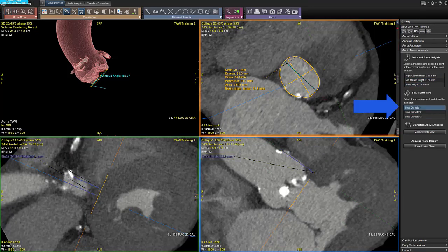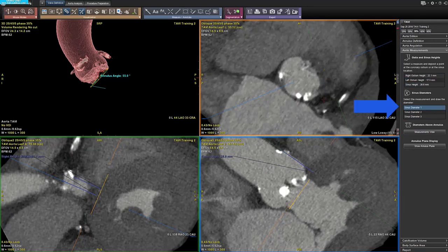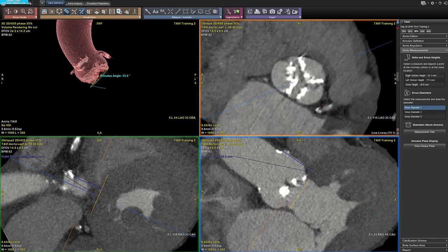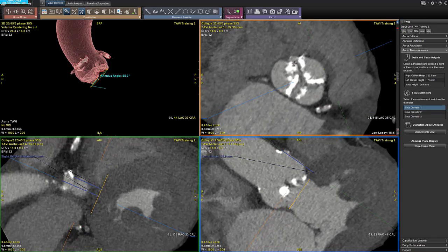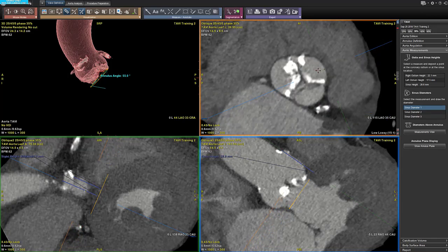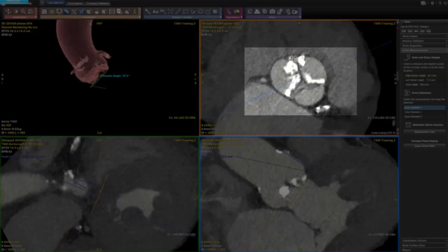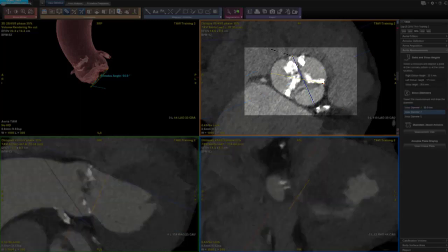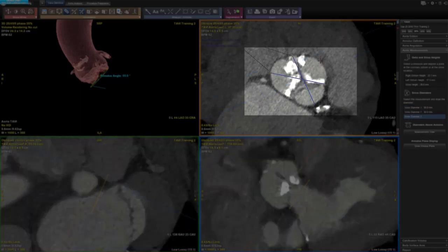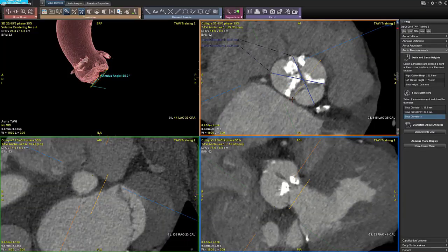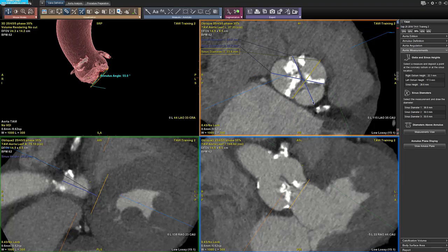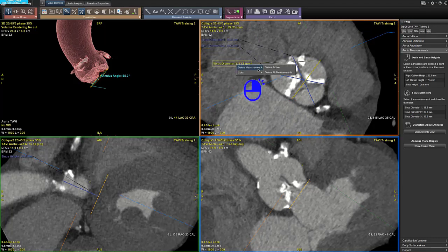For the sinus diameters, you select one measurement on the wizard panel. Then you draw the measurement from commissure to cusp. You can edit or delete the measurement by grabbing one extremity and right clicking on it.